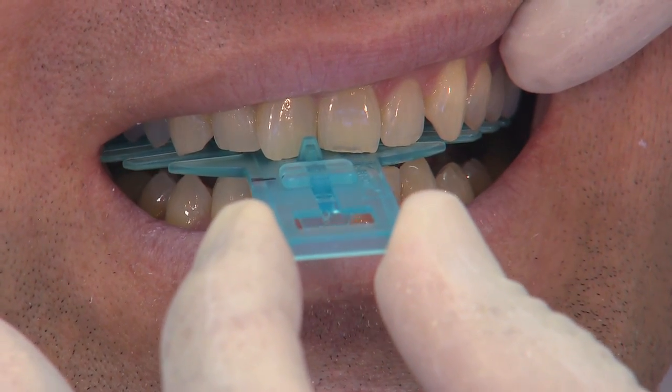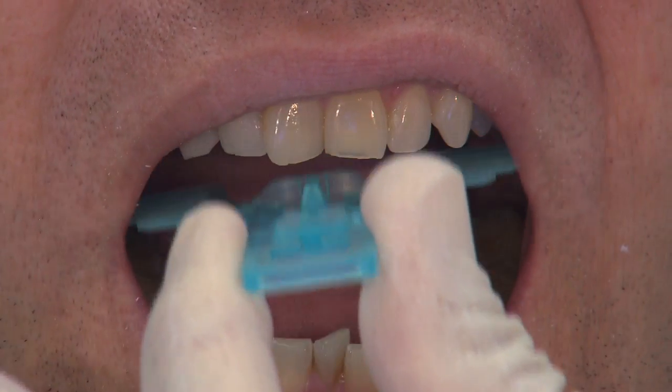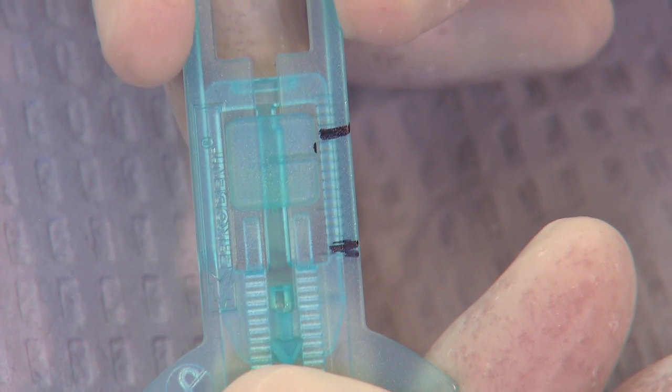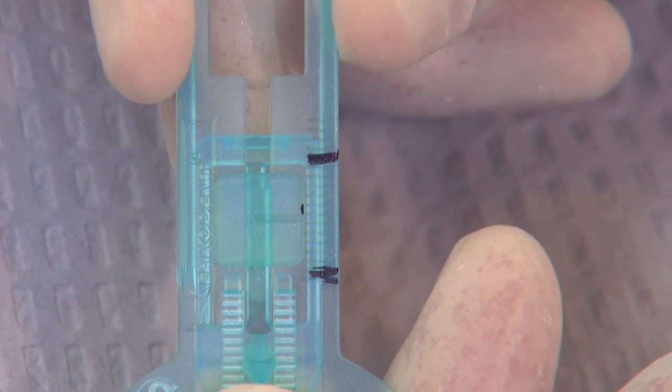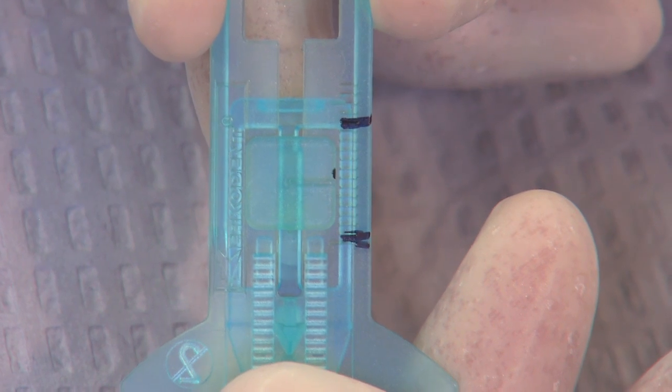Then I have him slide his jaw forward. You can see the mandible coming forward as far as he can go, and then I have him hold it there. And again, with the Sharpie, I mark his maximum protrusive range, where he's out all the way that he can possibly go. And then what we're going to do is set the gauge right in the middle of those two marks, between his normal bite and maximum protrusion. And that's where the laboratory is going to assemble this appliance to put him right there.